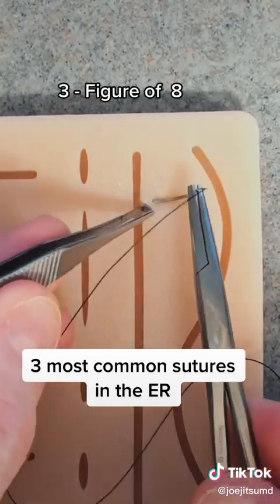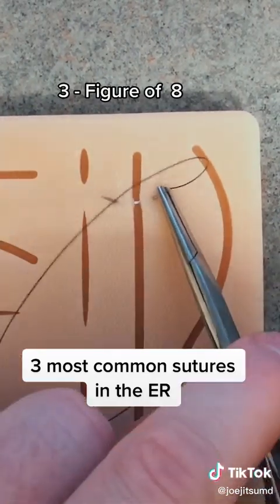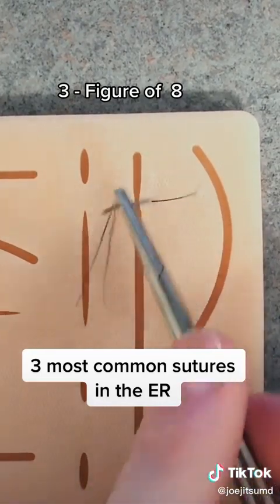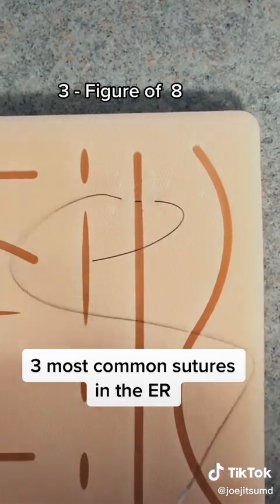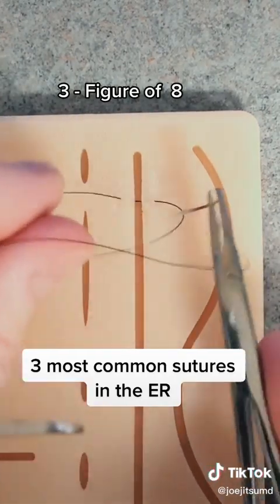The third most common suture type I use every day is a figure of 8 suture. As you can see, you go from one side to the other, just like the simple interrupted, but now you're going to make a second pass from the original side to the second side. This suture type is particularly useful when you have a bleeding vessel or varicose vein that won't stop bleeding.